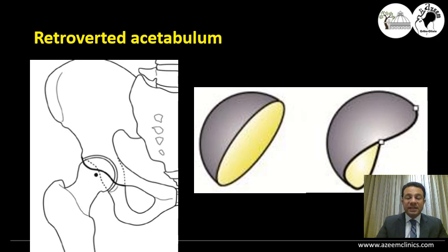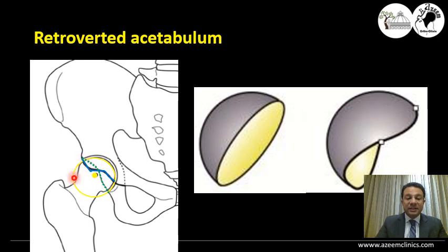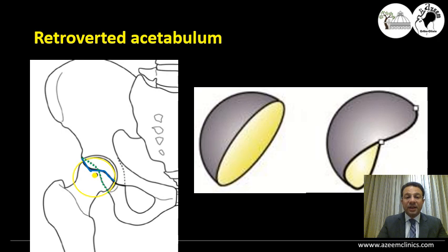In cases of a retroverted acetabulum, if you trace these lines, they will meet before reaching the upper part or the dome of the acetabulum, creating what we name a figure-of-eight sign. Additionally, the posterior wall sign will be medial to the center of the head. The posterior wall line should usually coincide with the center of the head — otherwise, this is a retroverted acetabulum.